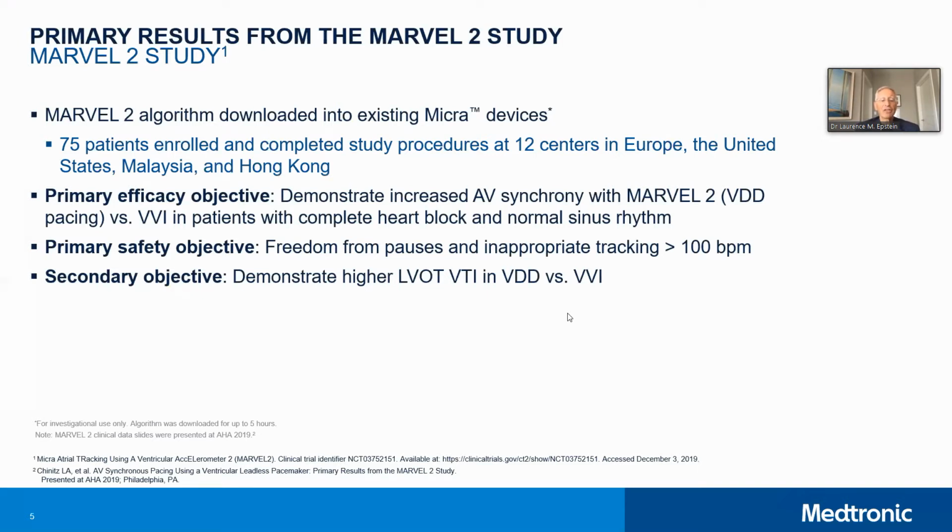And how we did that was we took patients, as Todd just told you, with existing Micra devices, and we downloaded the AV software, the Marvel 2 algorithm, into the device. One would ask, well, why can't we just do that with our existing Micra VR patients? Can't we just upgrade them without having to put an AV device in? And the answer is no. This puts kind of an excessive battery strain on the VR because it wasn't built for this.